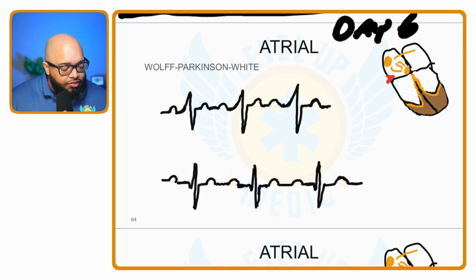Of course, all of this is due to sodium going into the cell. The Q represents the ventricular septum, the R represents the anterior wall, and the S represents the posterior wall. I've said this probably 50 times already.